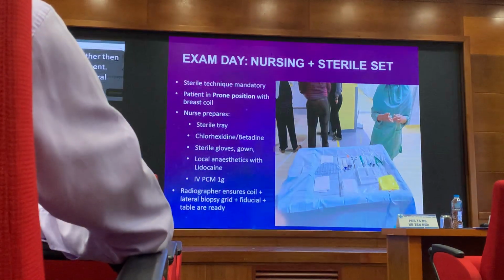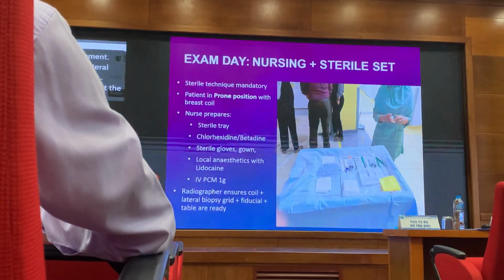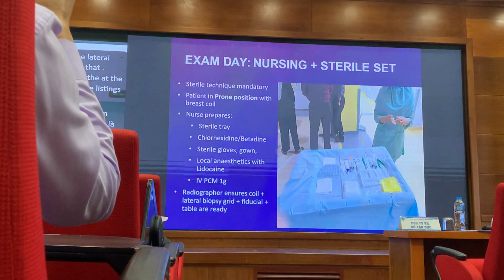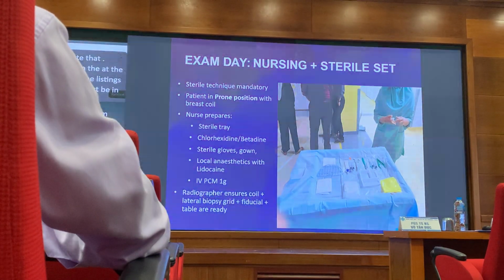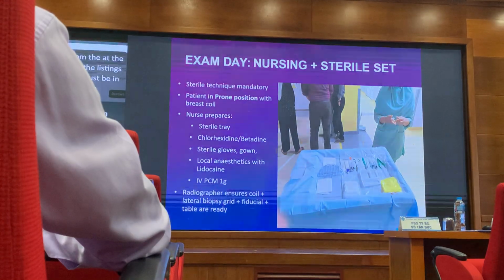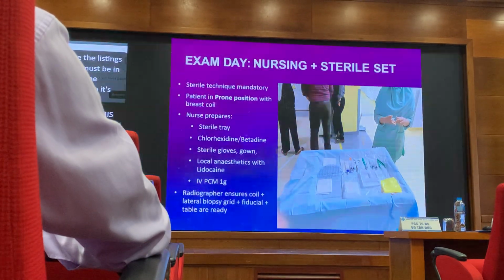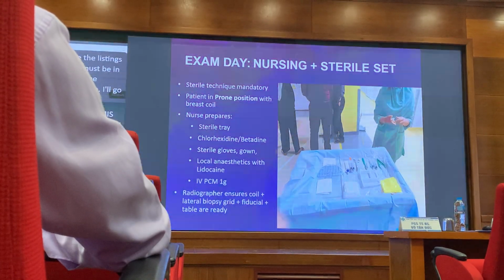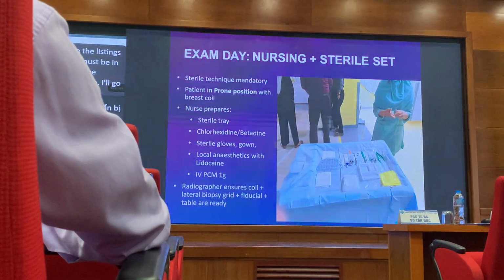On exam day, we will prepare the nursing sterile set. Everything must be sterile, and the patient is in a prone position with the breast coil. So a sterile tray, chlorhexidine, sterile glove, gown, local anesthetic lidocaine, and then the intravenous paracetamol 1 gram that we're using.